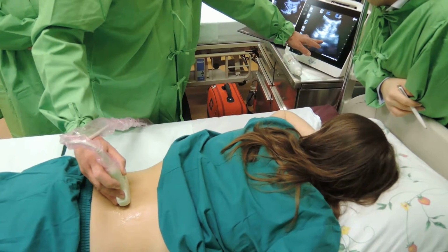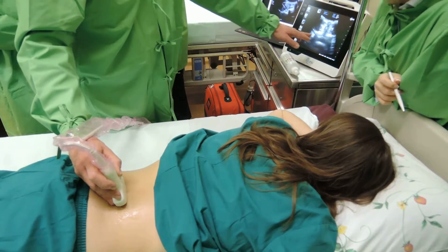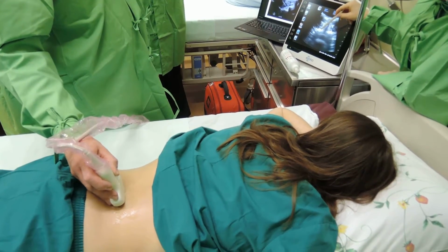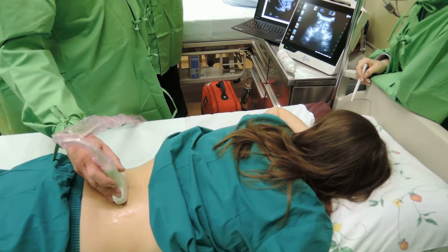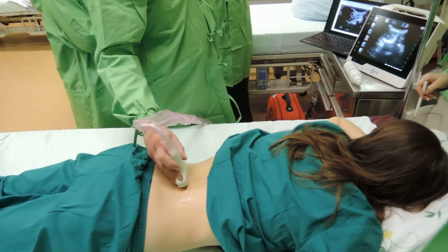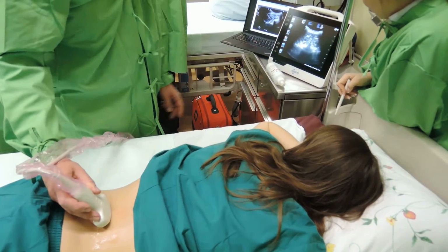And you have as well, similar to the long axis view, you can see the spinal canal with the posterior and anterior dura. Yeah. No, that's just for orientation: the spinous process, the lamina, the articular processes, and the transverse processes.